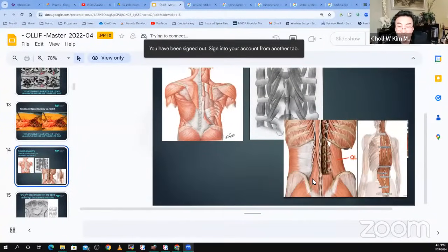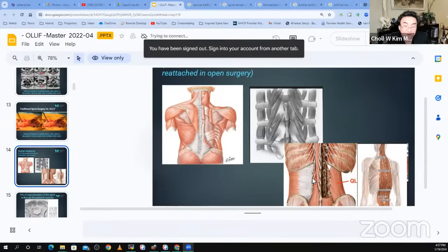When we do a minimal invasive fusion, we specifically try not to injure the muscle tendon complex of the level above. And guess what happens? Very few, not zero, because remember, half of it is genetic predisposition. I do very few adjacent level degeneration fusions after a minimal invasive fusion.